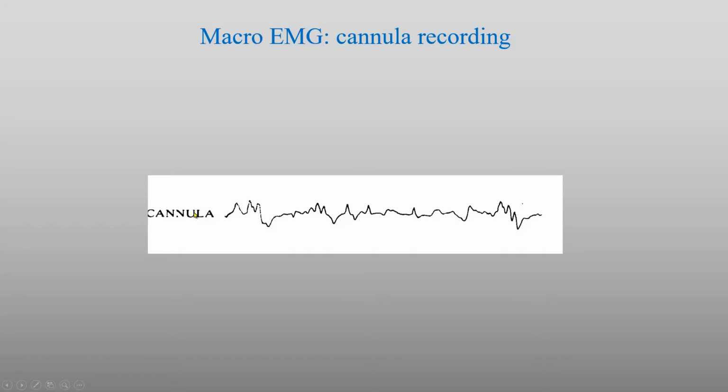If we just record from the cannula of some of these electrodes, then we see a signal where we do not detect the individual motor units because they are all a summation pattern.